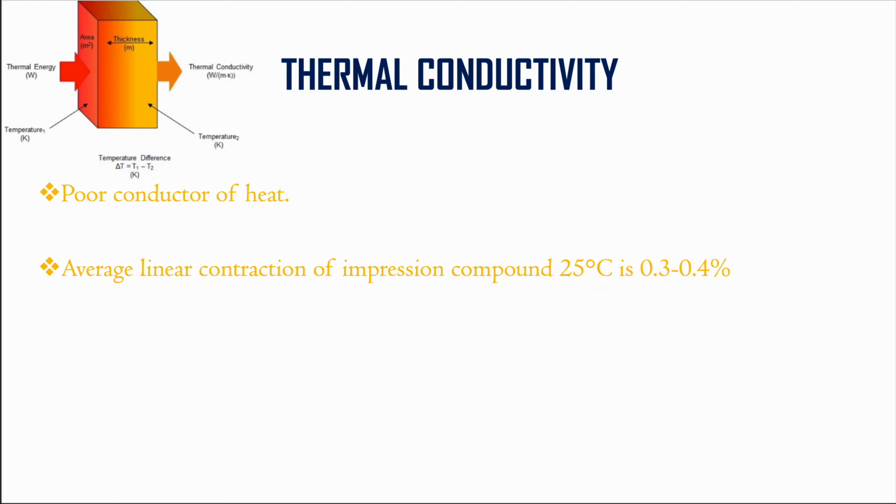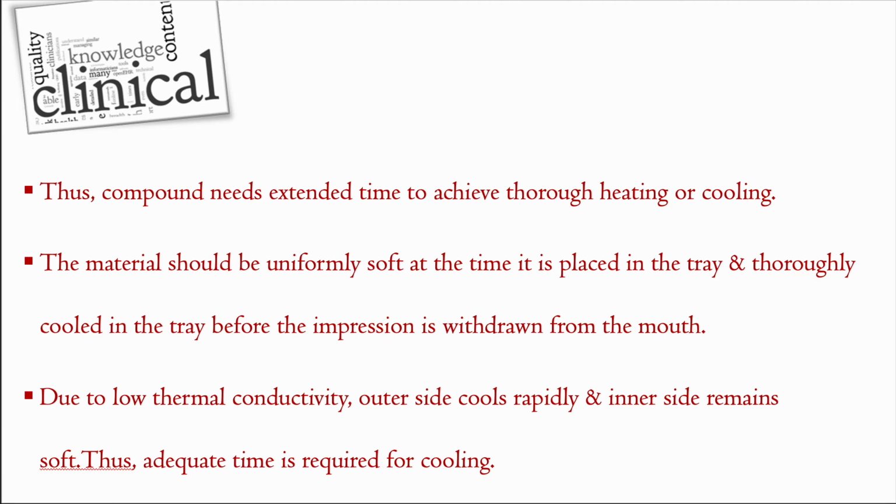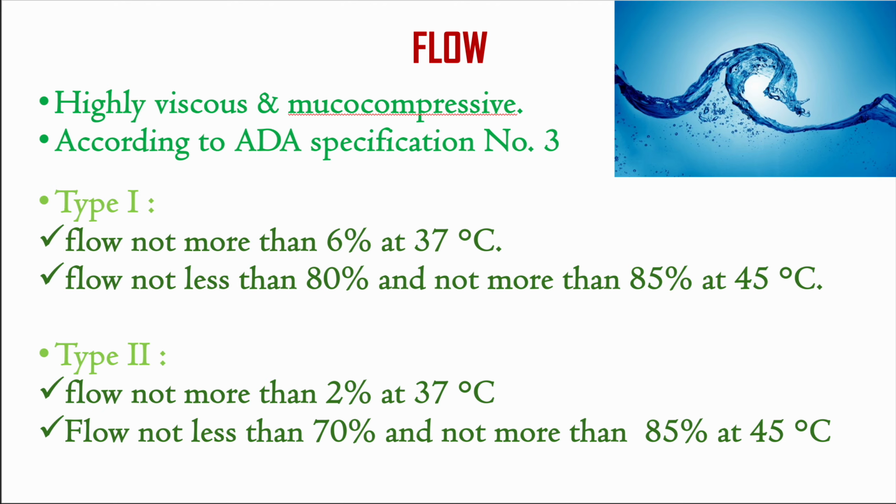Now coming to thermal conductivity. Impression compound is a poor conductor of heat. Average linear contraction of impression compound at 25 degrees Celsius is 0.3 to 0.4%. Thus, compound needs extended time to achieve thorough heating or cooling. The material should be uniformly soft at the time it is placed in the tray and thoroughly cooled in the tray before the impression is withdrawn from the mouth. Due to low thermal conductivity, the outer side cools rapidly and the inner side remains soft. Thus, adequate time is required for cooling.